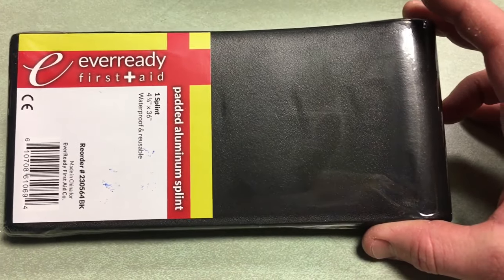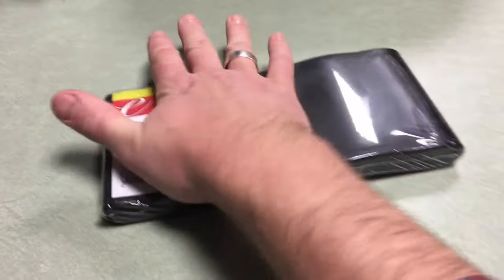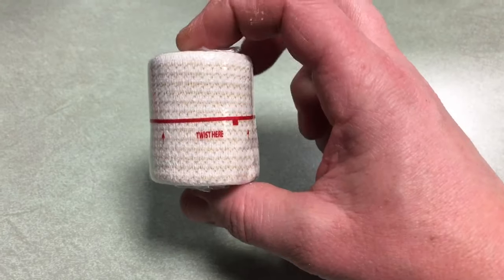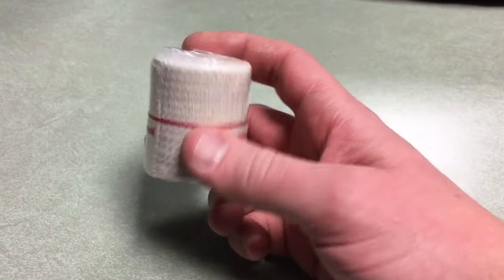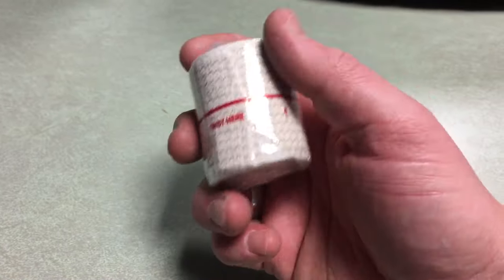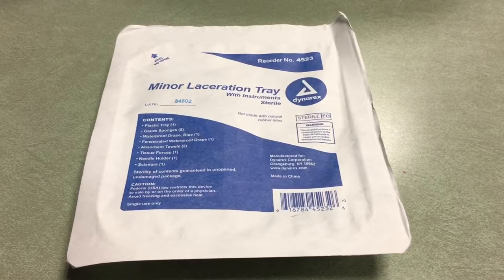Next up, we have the Ever Ready First Aid padded aluminum splint. It's lightweight, bendable, and moldable into whatever form you need — whether you're splinting somebody's leg, arm, or whatever. There are lots of other ways to create a splint, but it's nice to have one that's already there and ready to go. Also included is a small ACE bandage — you can use it for a variety of things, particularly wrapping around the splint to keep it stable.